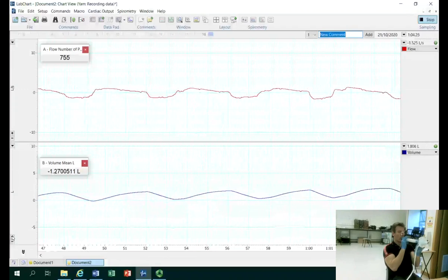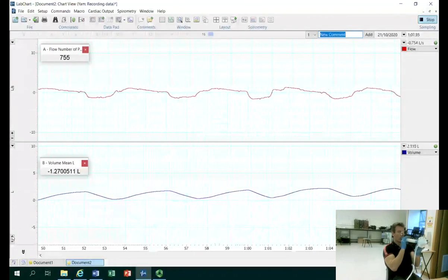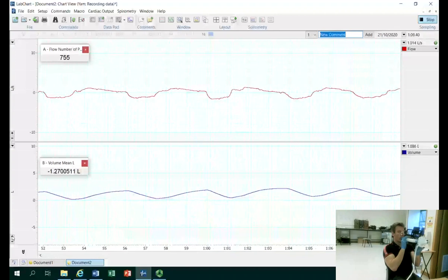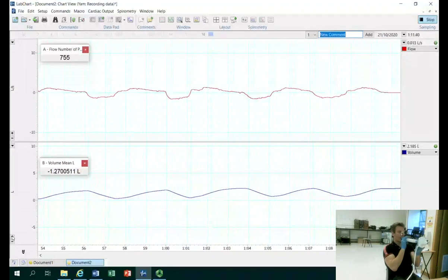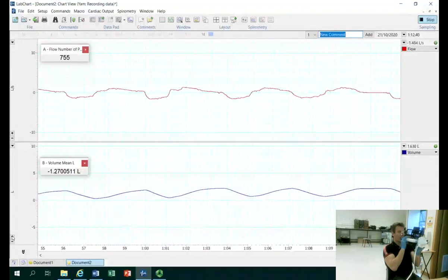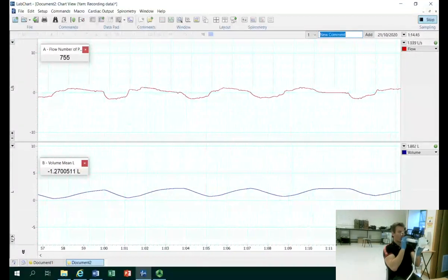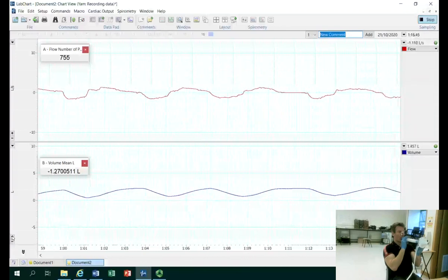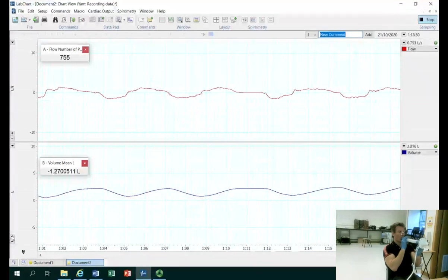We have about a minute's worth of data collected there. I'm going to ask the participant at this point, after maybe 2 or 3 breaths, when they get to the top of their normal tidal volume, to breathe in as far as they can and then breathe out as hard and fast as possible.